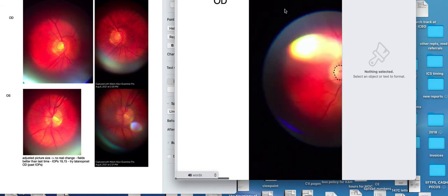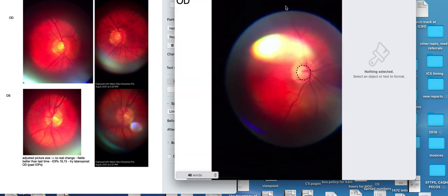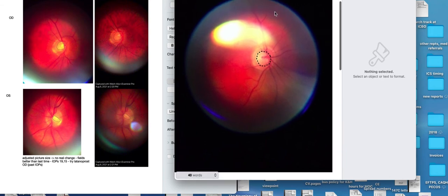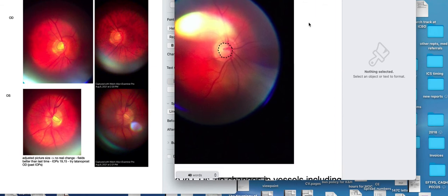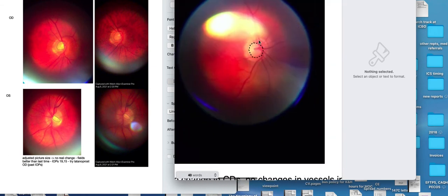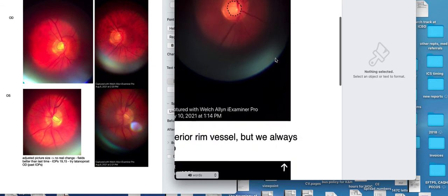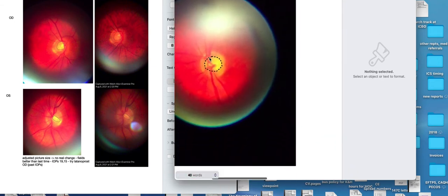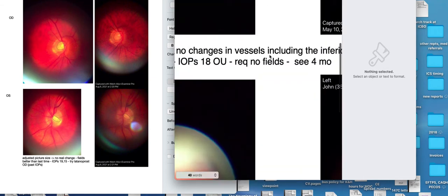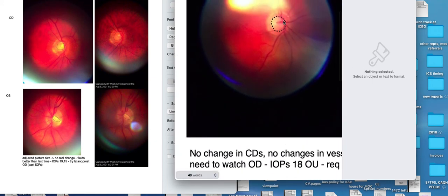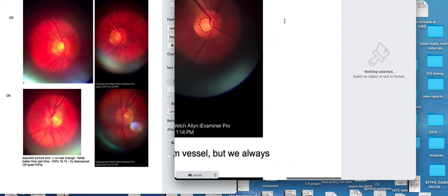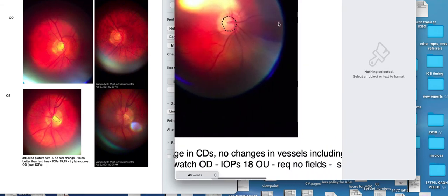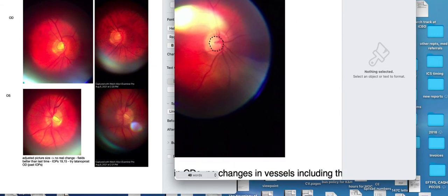This is a guy we've been following for high eye pressures for a long time. He is not interested in taking drops, anything like that. Notice, just like on the other picture, what I've done is I made an outline of the optic cup. There's the left eye, I made another outline there. And then what I can do is on the old picture, I can just duplicate this and move it over to the new picture, and then get an idea. It's not perfect, but I can get an idea if things have changed.